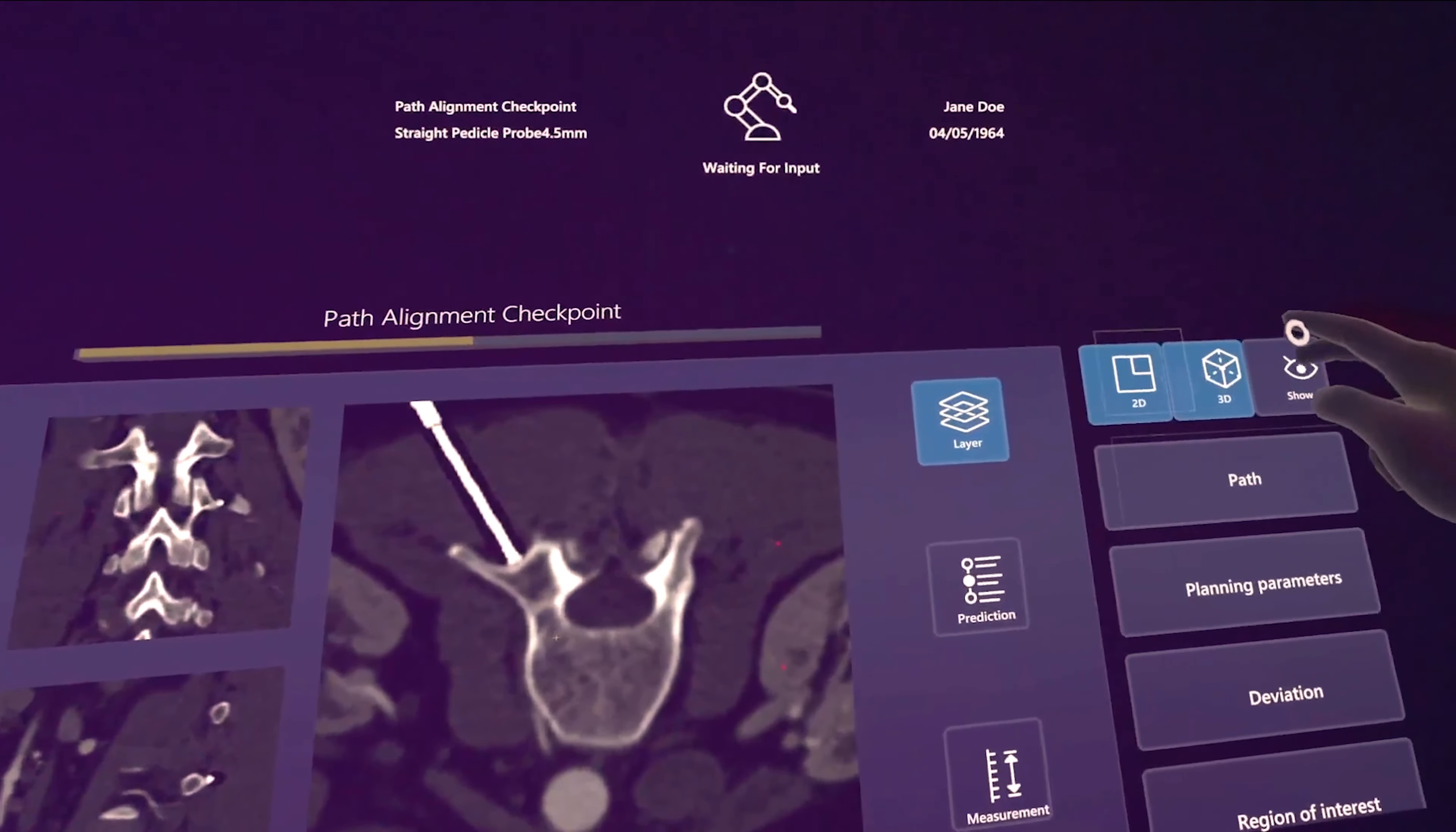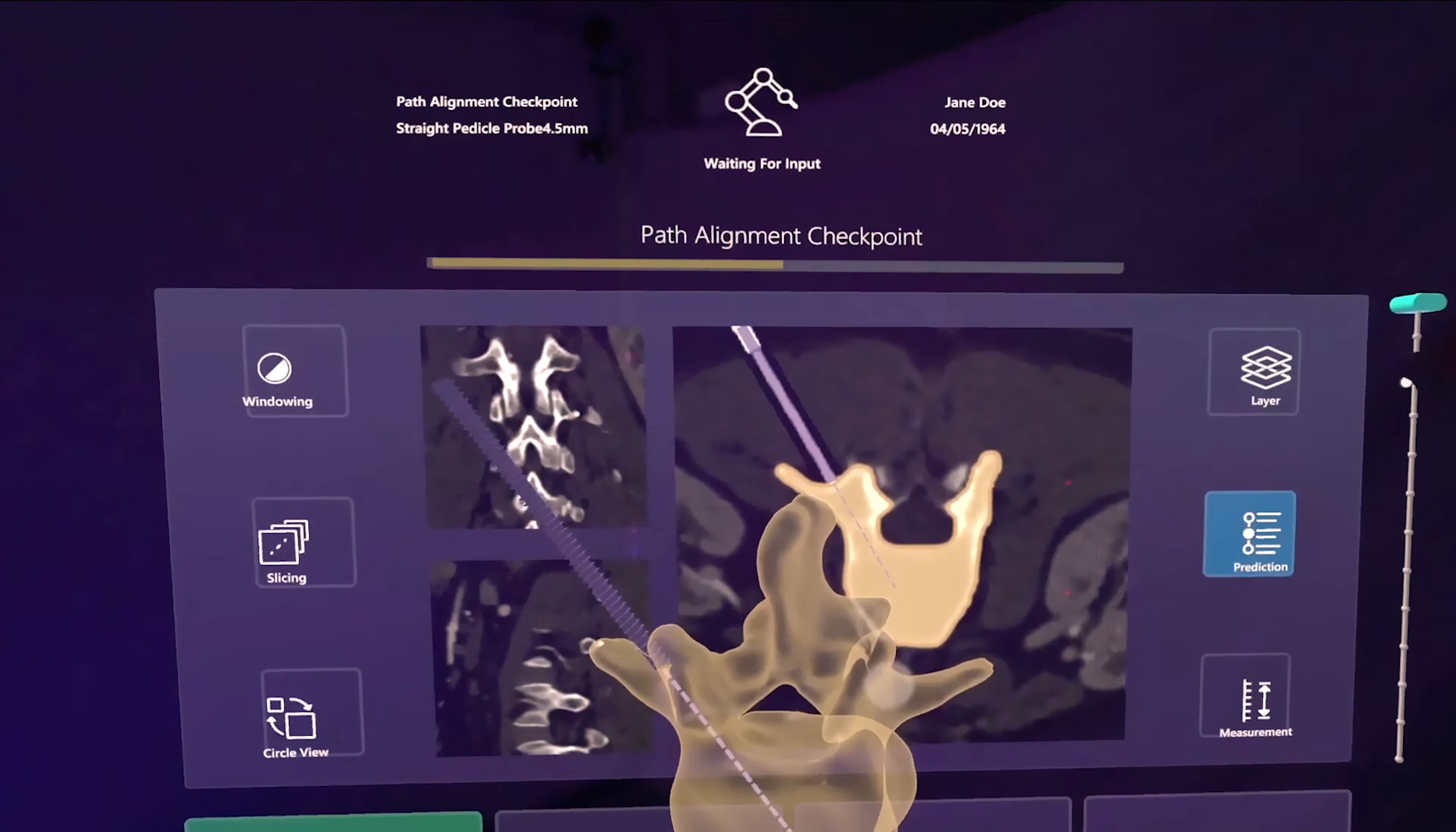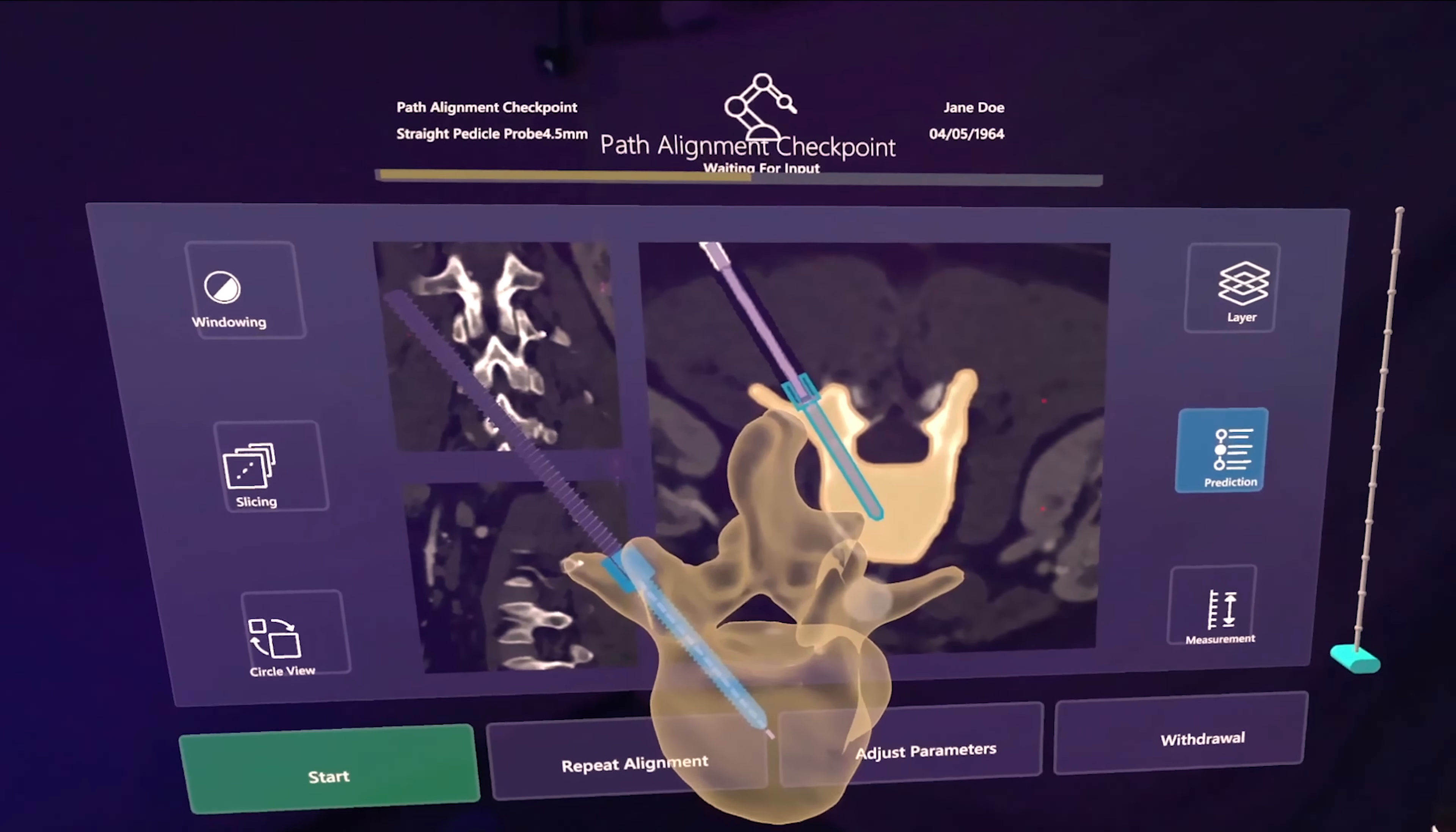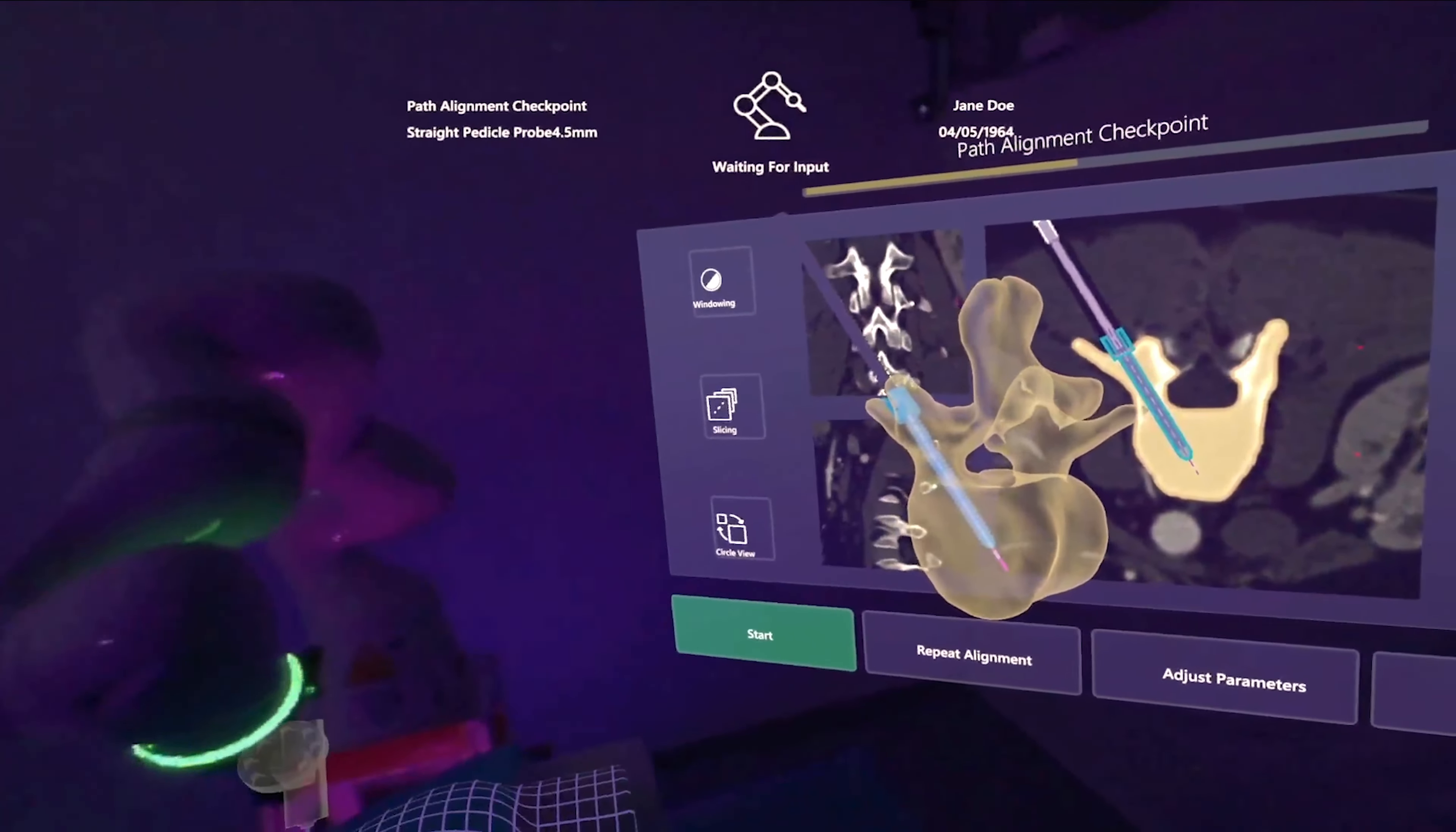The surgeon can also activate and deactivate various information layers. The surgeon can also view a prediction of the upcoming drilling process. Once the surgeon is satisfied with the robot orientation, they can start the drilling process.